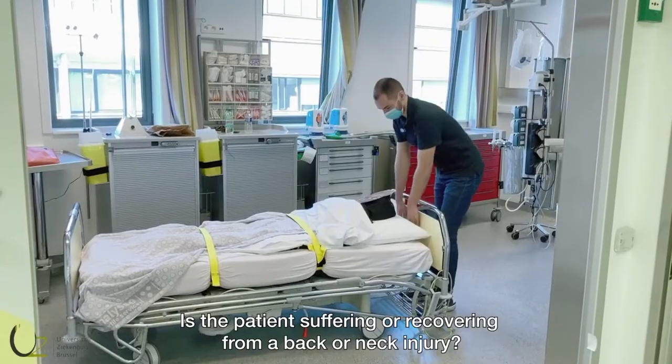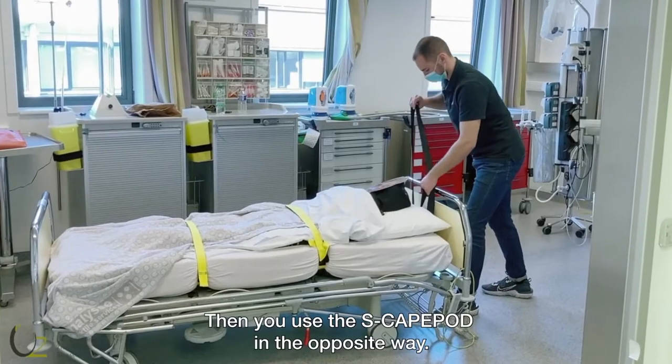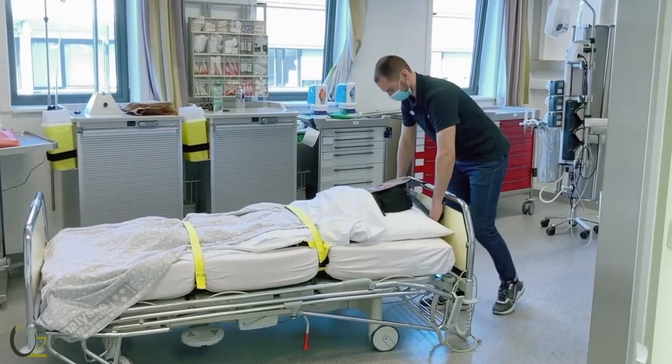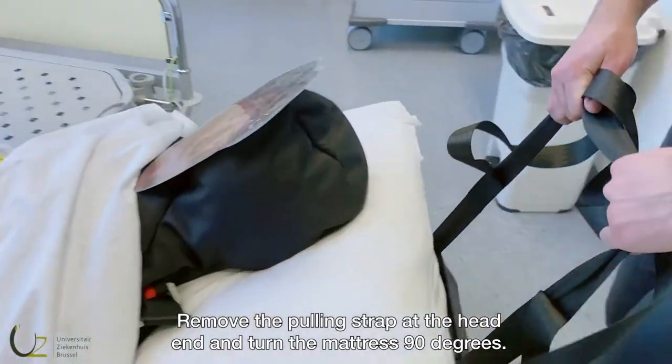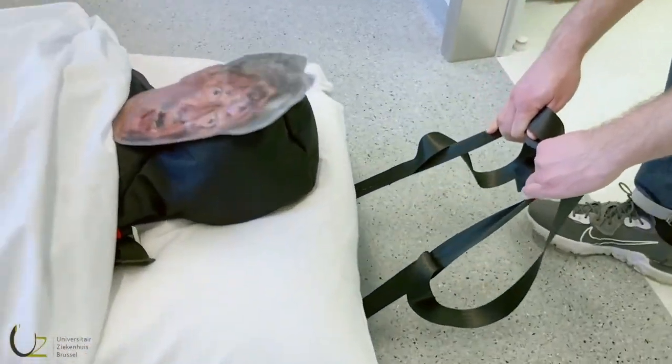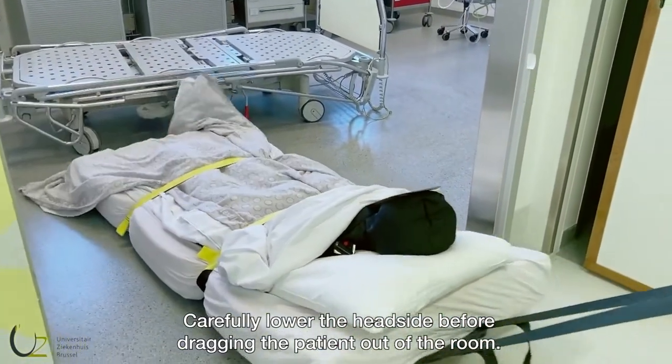Is the patient suffering or recovering from a back or neck injury? Then you use the escape pod in the opposite way. Remove the pulling strap at the head end and turn the mattress 90 degrees. Carefully lower the head side before dragging the patient out of the room.